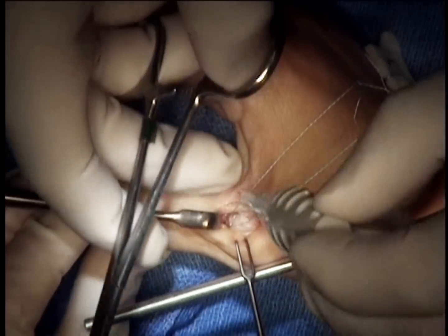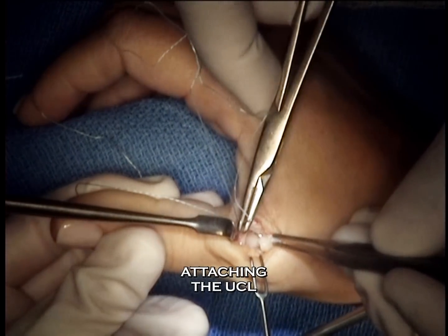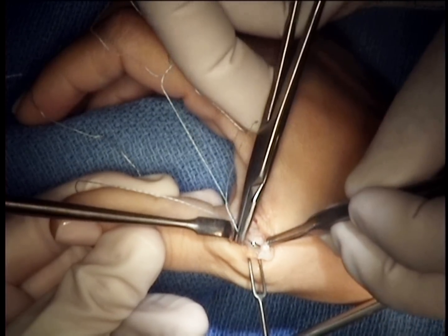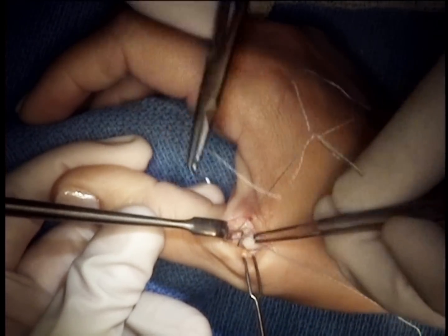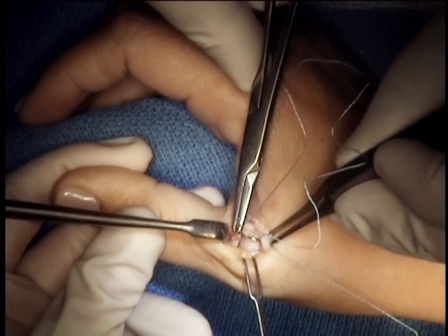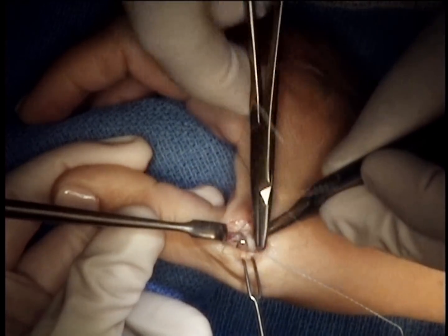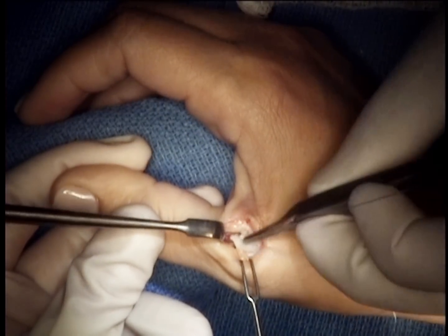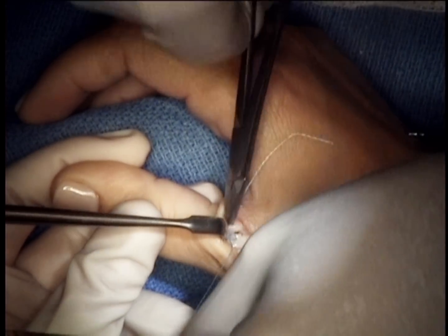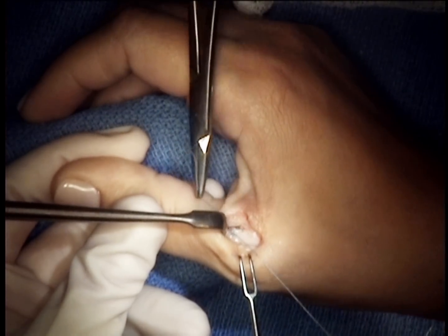Here the suture is being passed through the end of the ligament, which will be sutured down towards the area of the bony trough that was created. The second limb of the suture is passed, and as we place tension on it, we can see how we bring the ligament back down to its insertion site. It is important to hold the MP joint in the neutral position, perhaps with a slight amount of ulnar deviation, in order to minimize stress on the repair site.